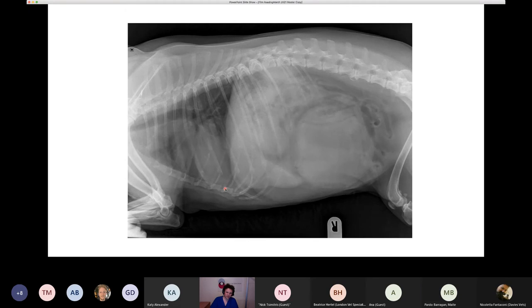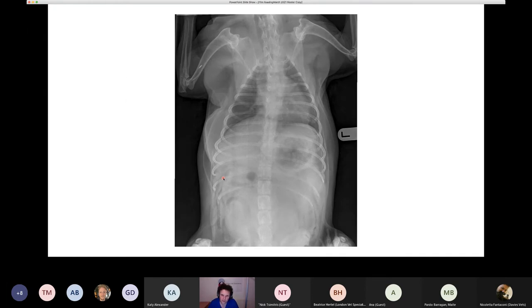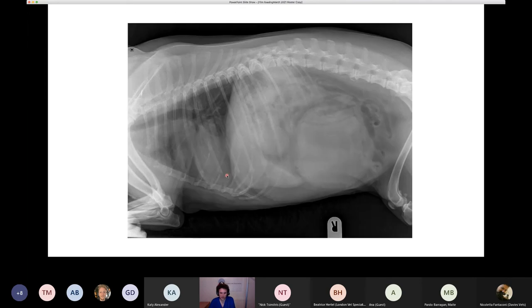And as you've said, the positioning is really suboptimal. So we've got some of the proximal caudal forelimb musculature superimposed over the cranioventral thorax. It's a little bit oblique as well. So it isn't the best view. And there's nothing in this DV really to make us too suspicious about an effusion. However, you are absolutely right that there is a large, clearly marginated soft tissue opaque structure in the mid-abdomen, and that is displacing a lot of the structures around it, predominantly the small intestine, which is displaced dorsally and also caudally. I agree, normally we'd expect to see the spleen in this location. Potentially a soft tissue shadow just superimposed over the liver and this soft tissue mass, but it's a little bit more radiolucent relative to the liver and this mass. It could be a bit of a spleen, who knows, but certainly a mid-abdominal mass.